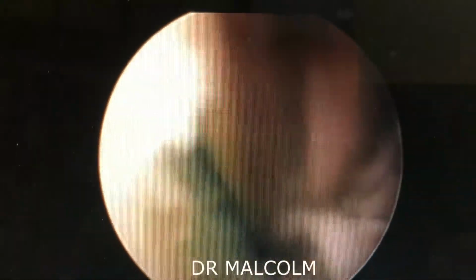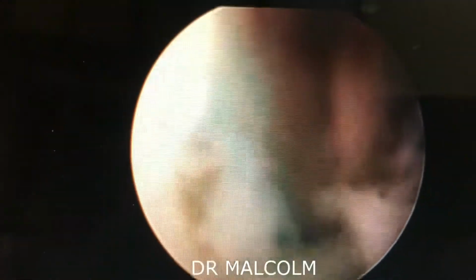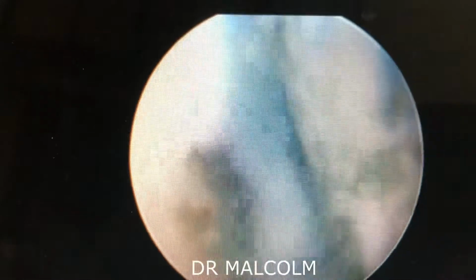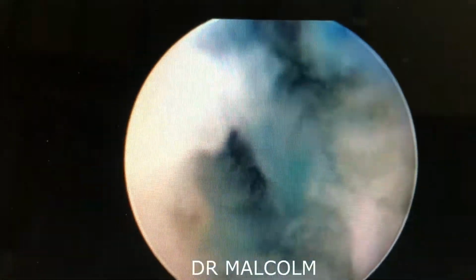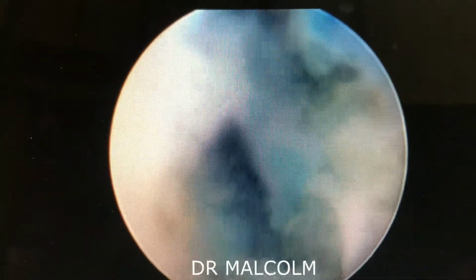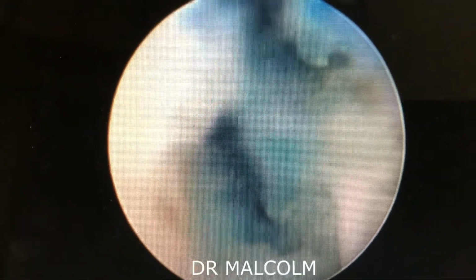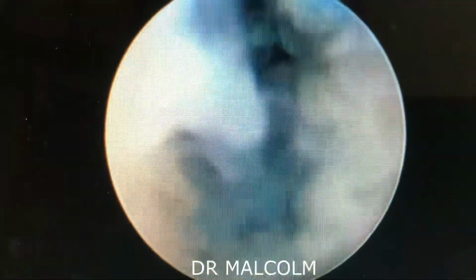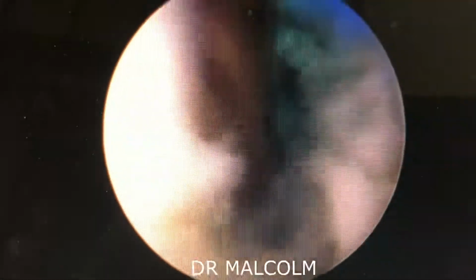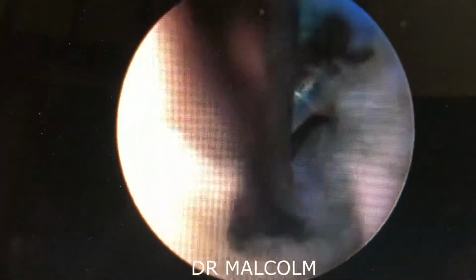There is a tissue tag in between, but one can see beyond it, and one can keep on removing large chunks of nuclear material from within the rent and the collection zone around the tear. It is of paramount importance to clear the tear and the collection zone of nuclear material completely prior to doing IDET kind of annuloplastic repair.